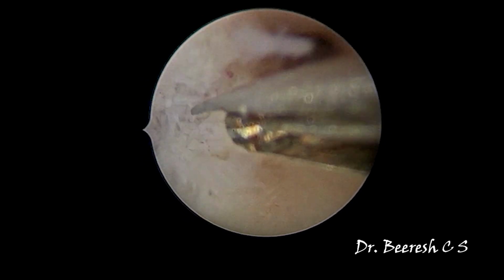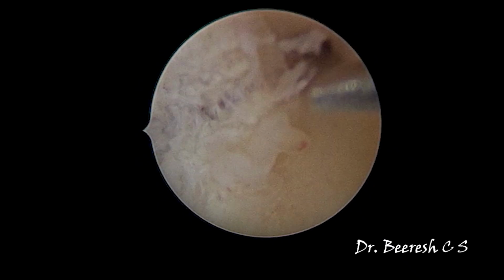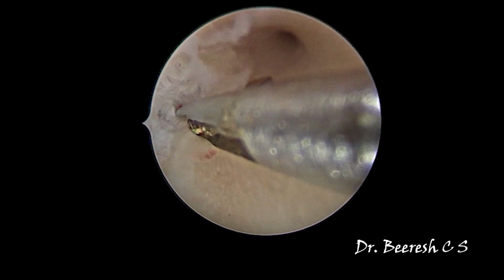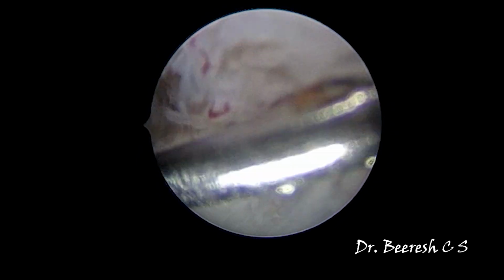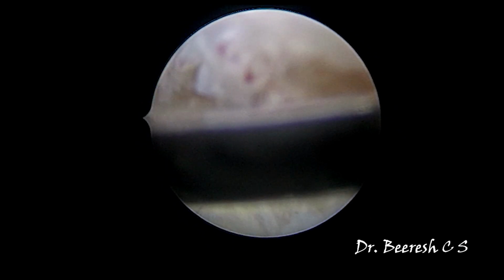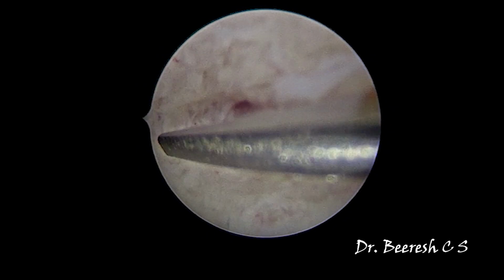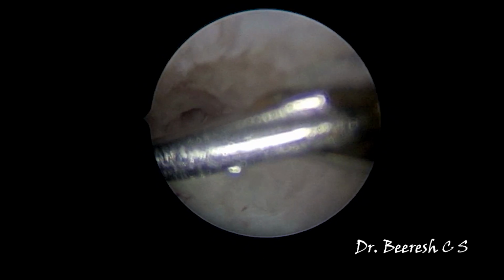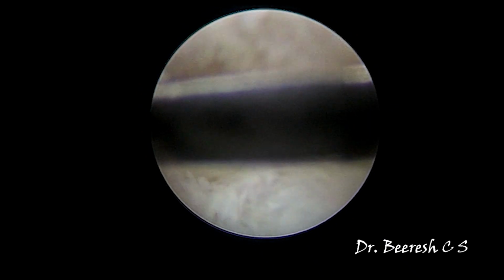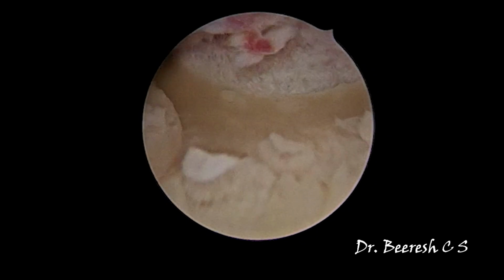So that's not the final completion of the surgery. I will take a look back and see whether it is complete. With the view from the internal os, I feel that the left side of the ostia is still not visualized. So I'm coming back and again fashioning a little bit of the lateral projection, trying to see whether I'm in line with the ostia.